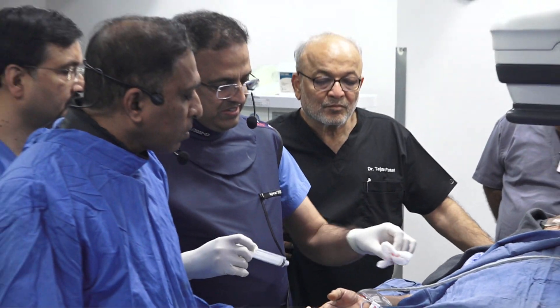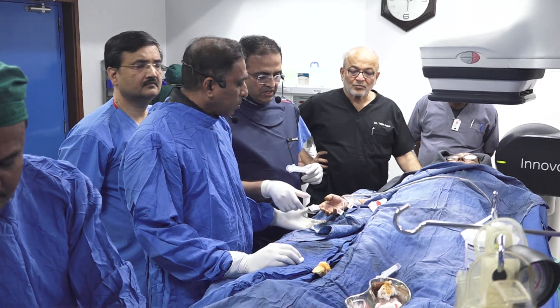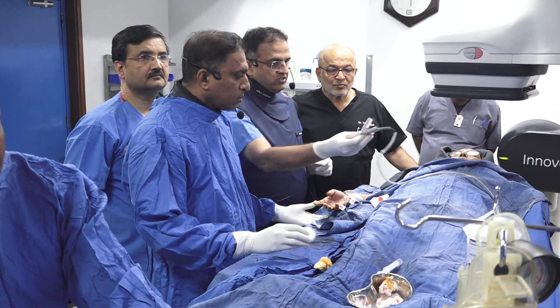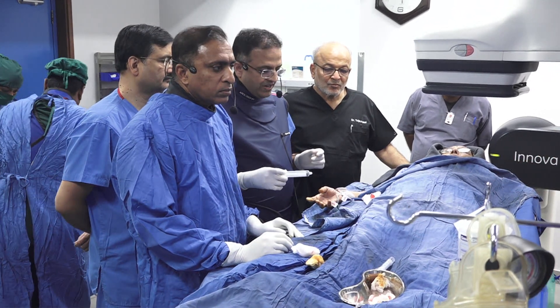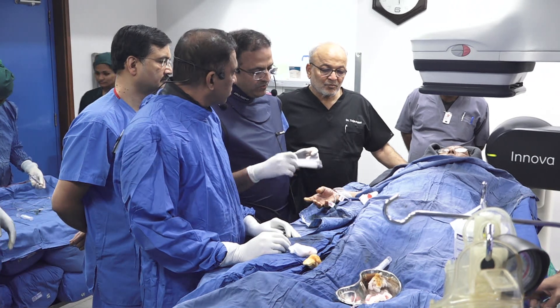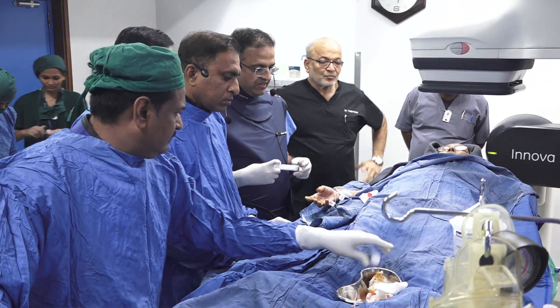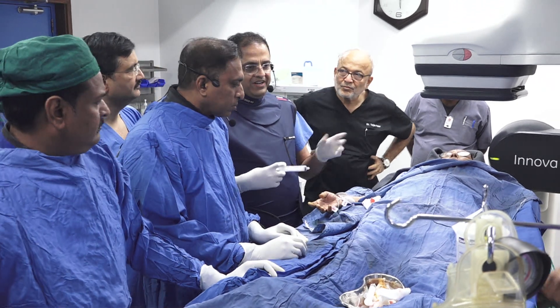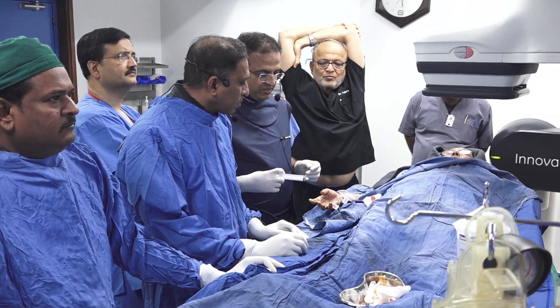Question: Different sizes or just one size fits all? Two sizes: this is the 26cm, and there is a 29cm for a very large hand. Her hand is very small but the 26 fits well. And for the left radial, you just flip it the other way around? No, we have a left radial band also, but you could flip this and it works as well as any other band.